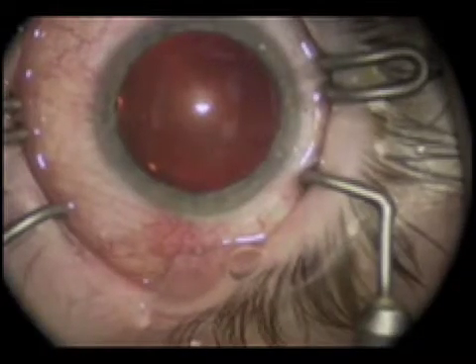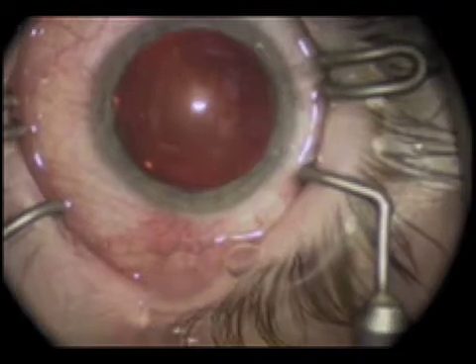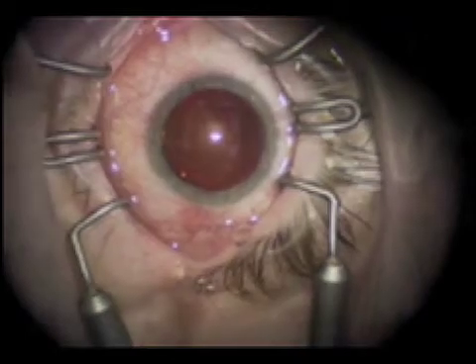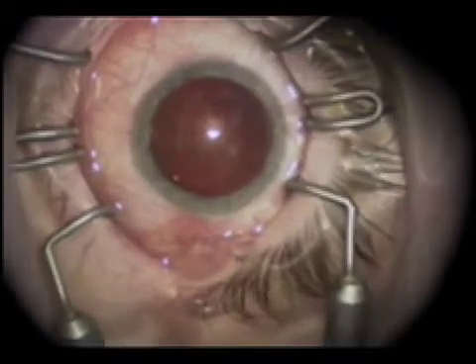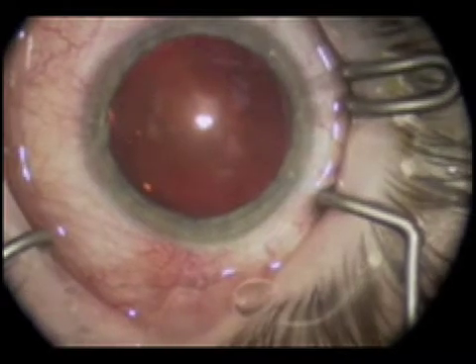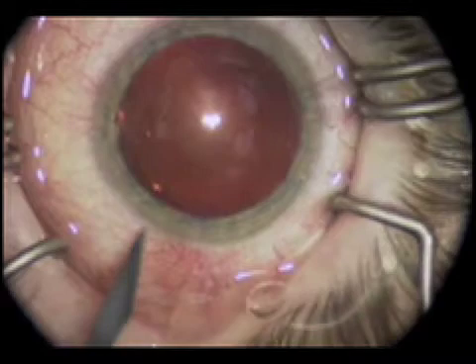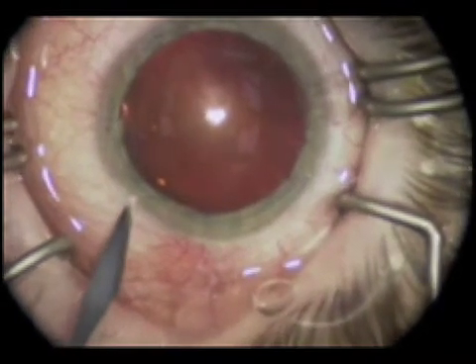The goal of the triple post speculum is to eliminate problems with exposure. By opening the lids in an oval shape, the speculum takes advantage of the natural geometry of the lid. The addition of the central post alleviates the middle portion of the lid and maximizes the available circumference in a shape that optimizes exposure.